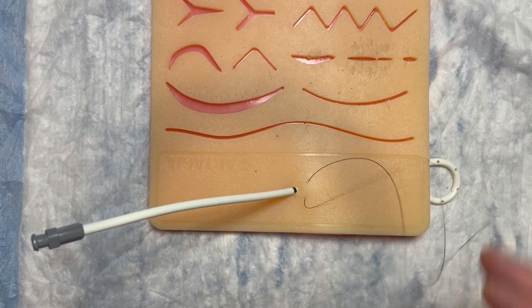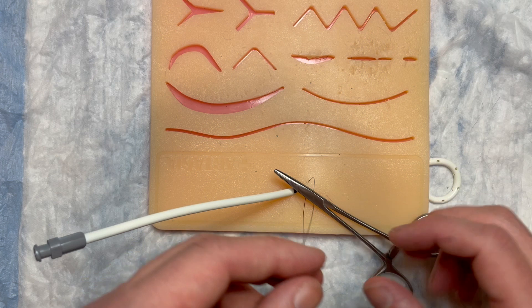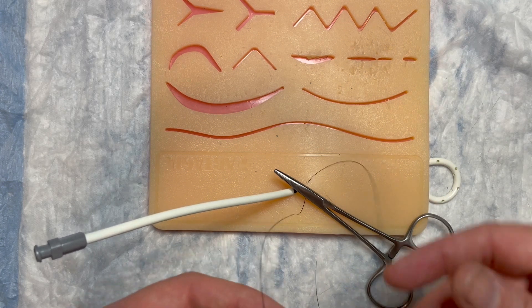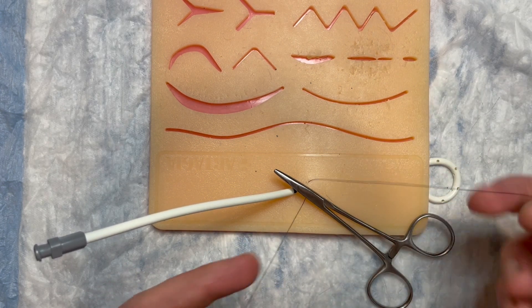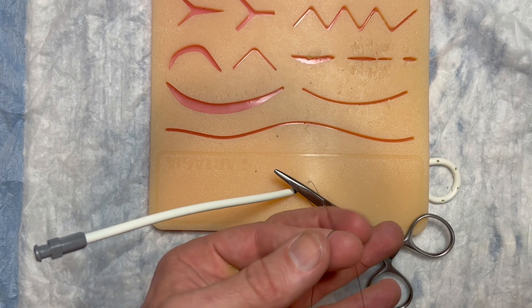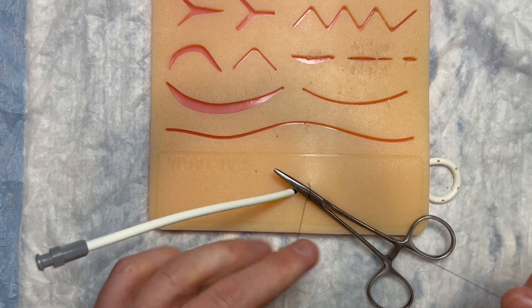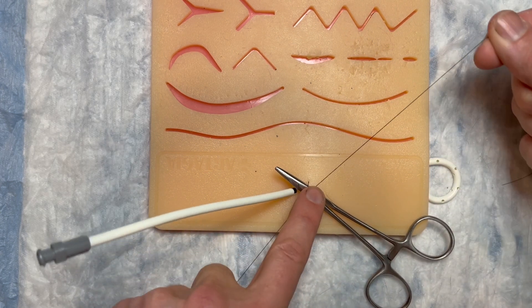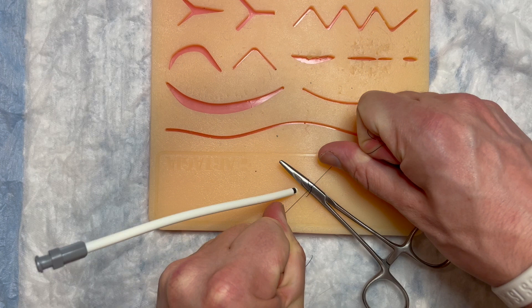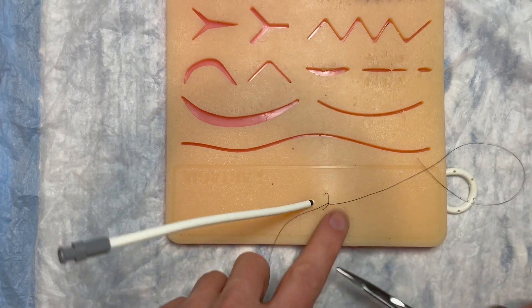So what we want to do for this first knot is we want to create a little slip knot, so what we can do is put our hemostat down. It's actually going to be an air knot but we're going to tie it like a slip knot. There are many different ways, you know, we got a two hand tie, a one hand tie, and there's plenty of videos on that. So I'm just going to do the same motion for both, and I'm doing the same motion for both so that I can cinch down and make this knot as tight as I want.